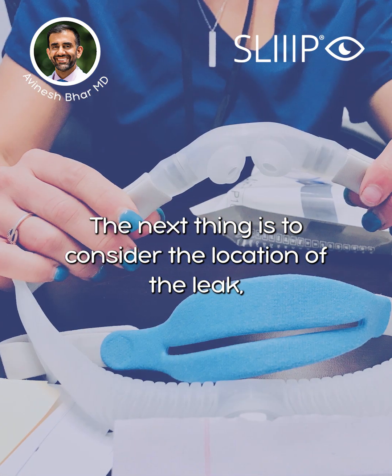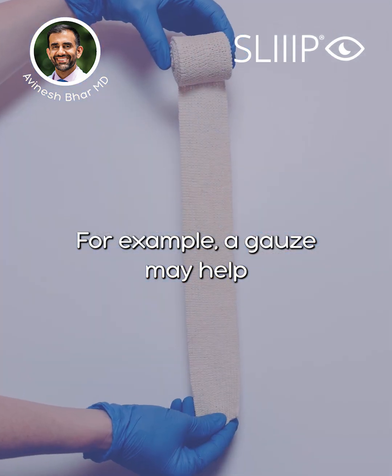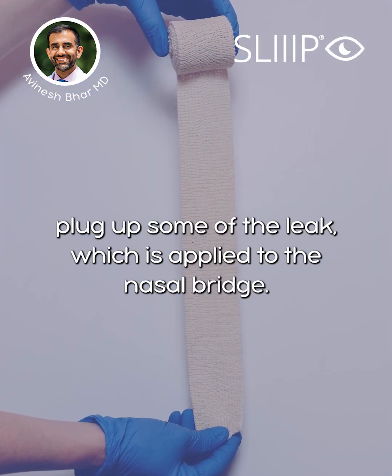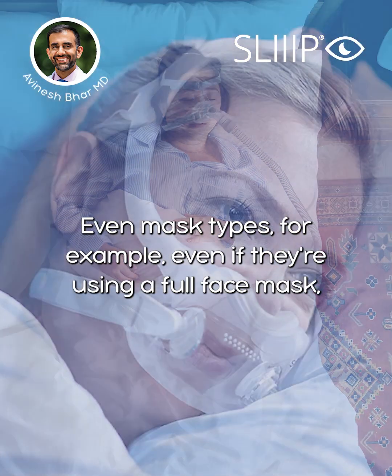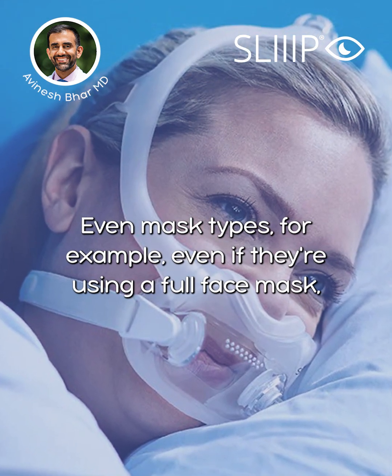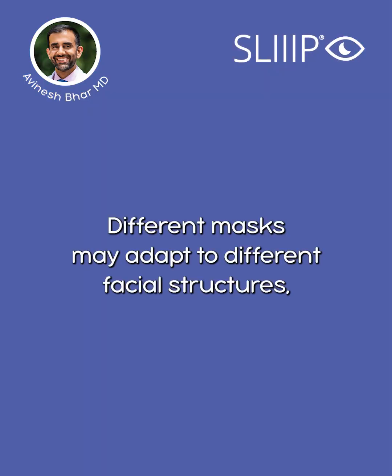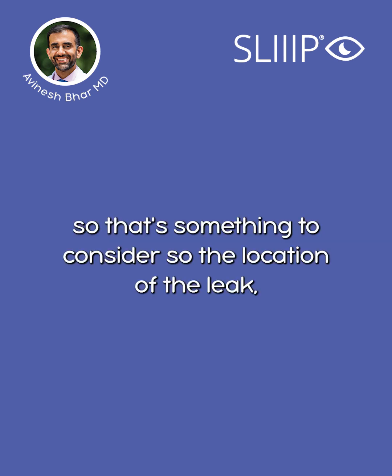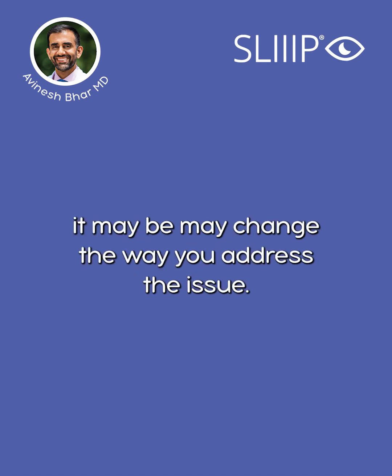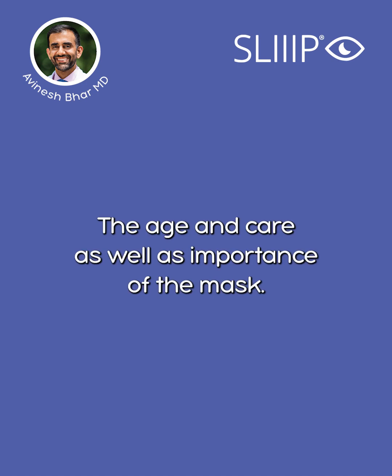The next thing is to consider the location of the leak. Now, if the location of the leak is around the eyes, for example, a gauze applied to the nasal bridge may help plug up some of the leak. Different kinds of masks as well, even if they're using a full face mask. Not all full face masks are built the same. Different masks may adapt to different facial structures, hence plugging up the possible leak that irritates their eyes. So that's something to consider. So the location of the leak, especially if it's in the eyes, may change the way you address the issue.